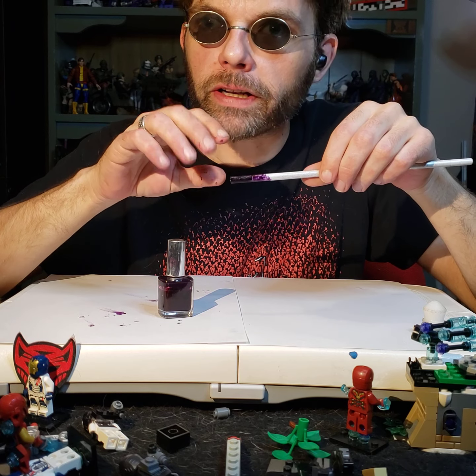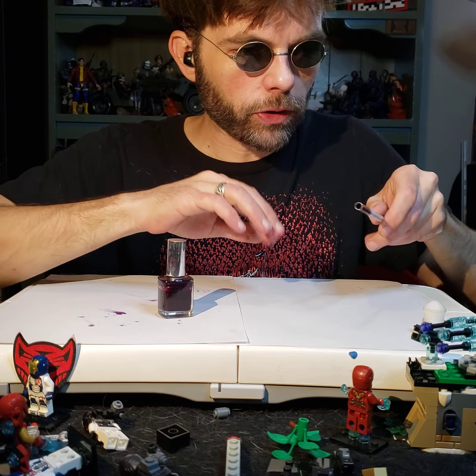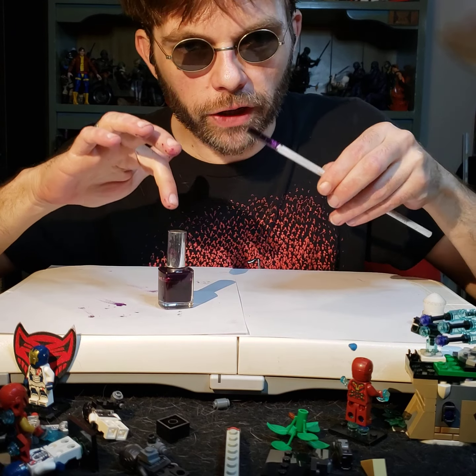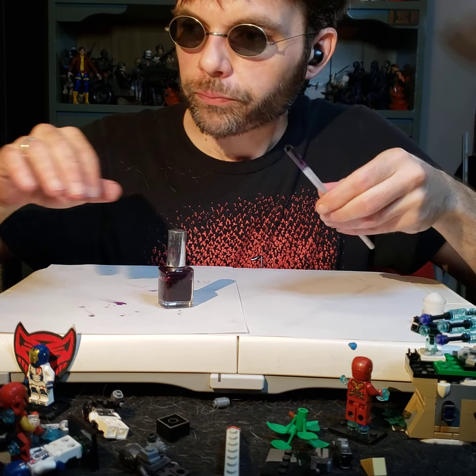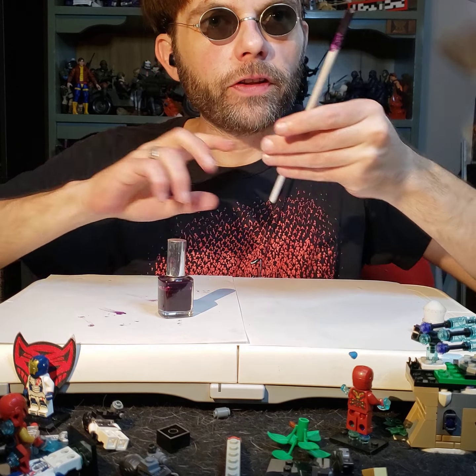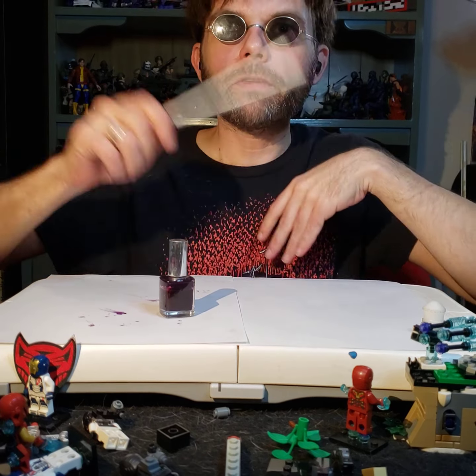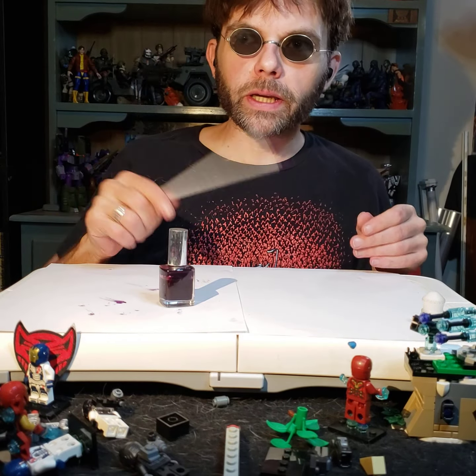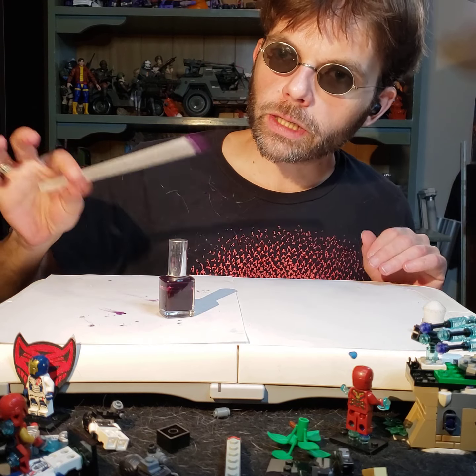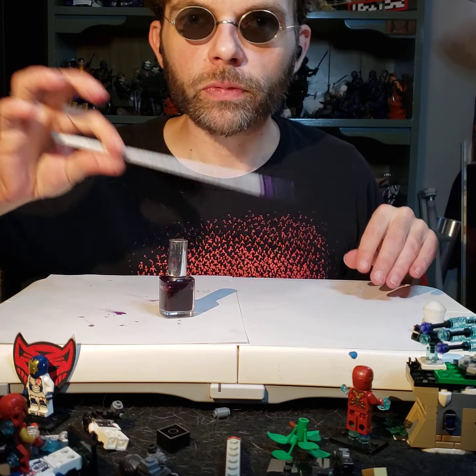Oop. I hope I didn't actually put my lips on it. Oh, it's still tacky. Okay. I don't have any cotton balls or anything like I'm supposed to. If I had thought ahead, I would have put some sticky tack down so I could just set this up in a vertical position to continue drying. But we're just going to have to swing it back and forth, I guess. Swinging the cane around, hoping I don't hit anything. Swinging my cane around, hoping I don't make a mess. Okay.